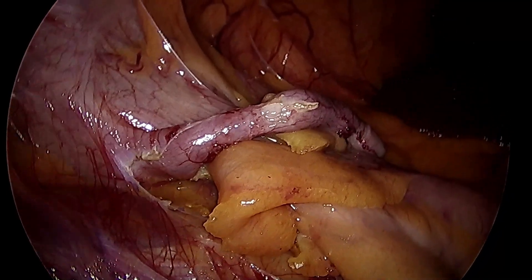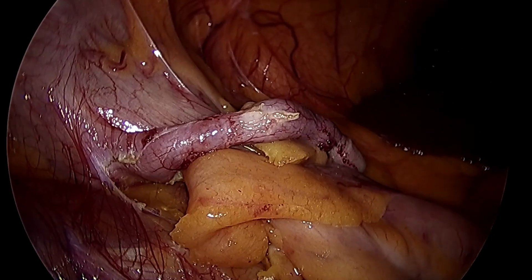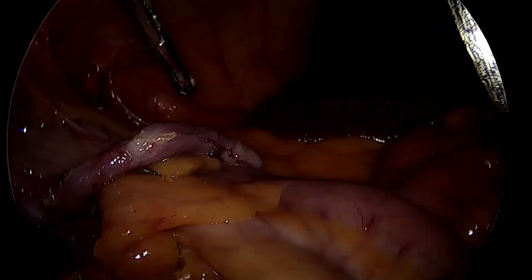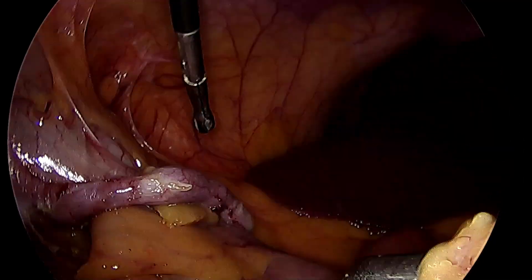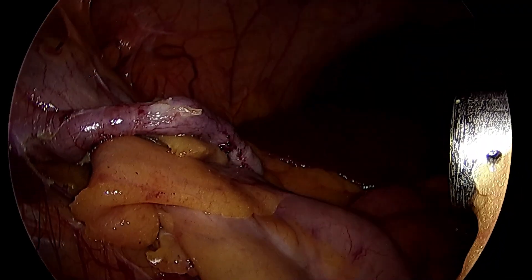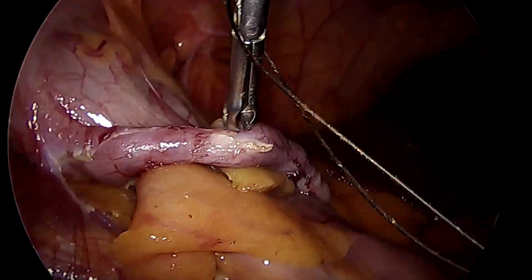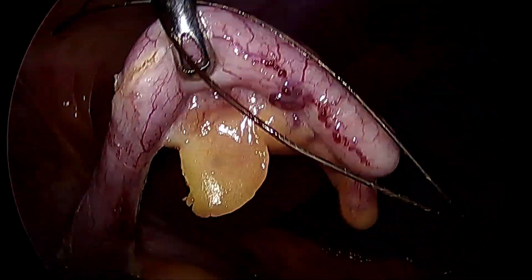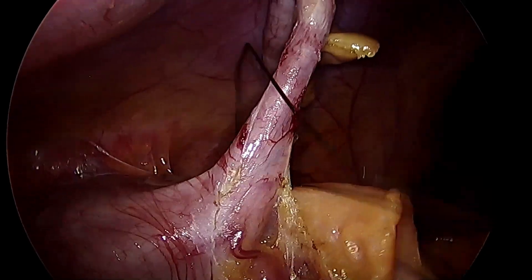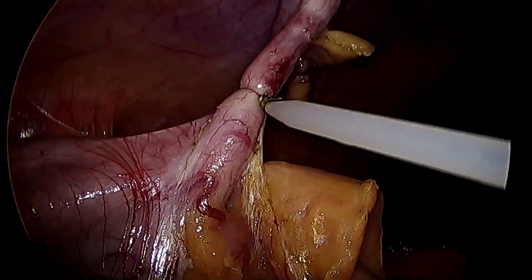It's a fairly simple part — the appendectomy was fairly simple. I'll now ligate the appendix at the base and then I'll be shifting to the cholecystectomy part of the operation.